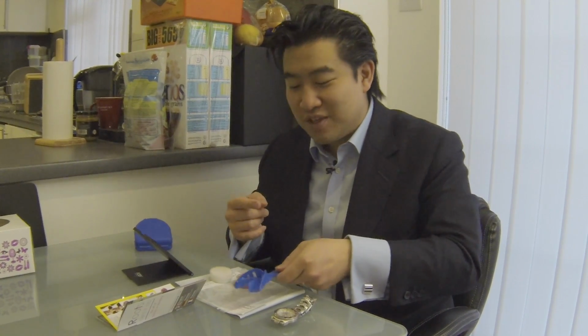So you want to put it in, and bite down. And then you keep it as central as you can to the mirror. You've got to have a mirror so you can see that this is right down the centre. You hold it in there for 2 to 3 minutes, and then it starts setting quite hard. So you need to spend the next 2 to 3 minutes trying to carefully pull this guard out, pretty much in a straight vertical line out of your teeth.